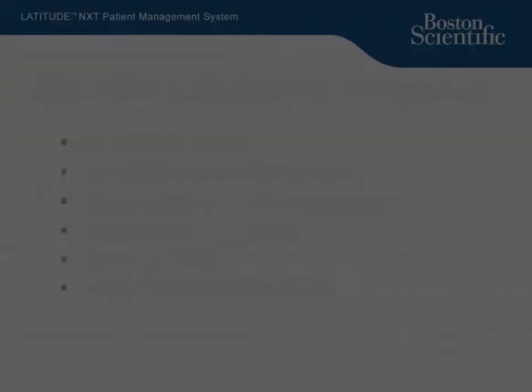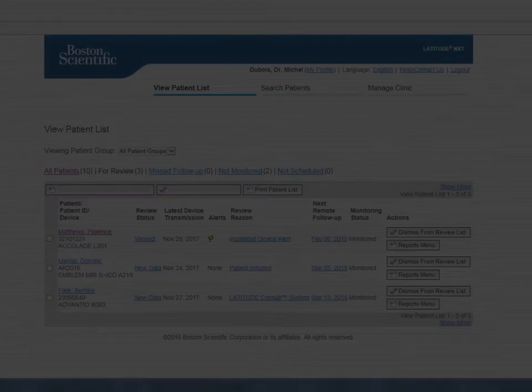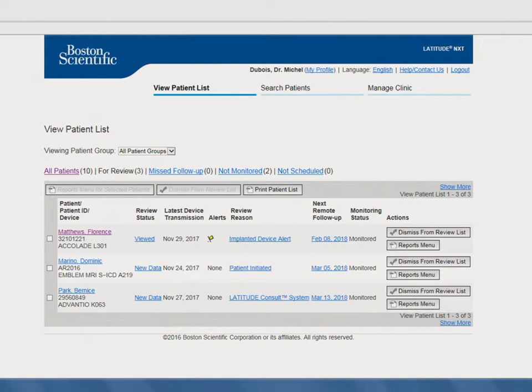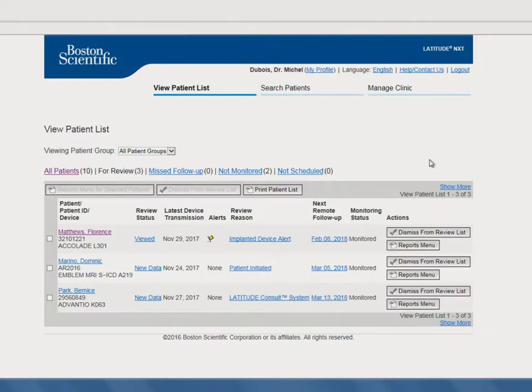Now we'll show you three of the ways you can quickly access your patient's recent alert information. The first way is from the View Patient List page. Locate the patient whose alerts you want more information about, then click on the flag in that patient's row. A pop-up window appears that provides some basic information about that patient's recent alert conditions. The second way is by clicking on the hyperlink in the Review Reasons column in that patient's row. A different pop-up window appears with more detailed information than what you saw with the alert pop-up window.